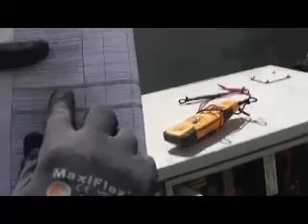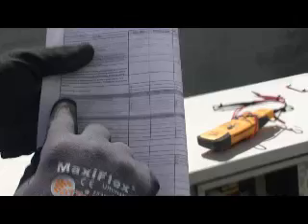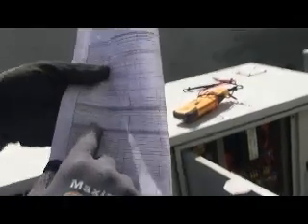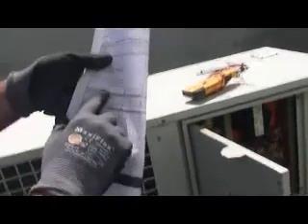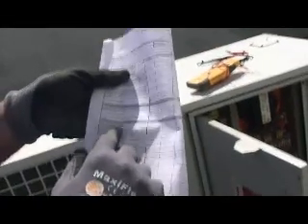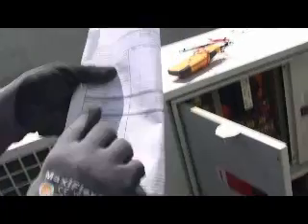I verified the pump, and we recorded the flow rate from the MRI controller. That is just the coolant from the back of your machine. You do not have to do that inside. You can just take the temperature of your pipe coming out of your machine here. Your discharge pressure of the pump comes off your gauge that we showed you inside the machine. And then your running current of each phase, which is like 3.5 amps, we took that.